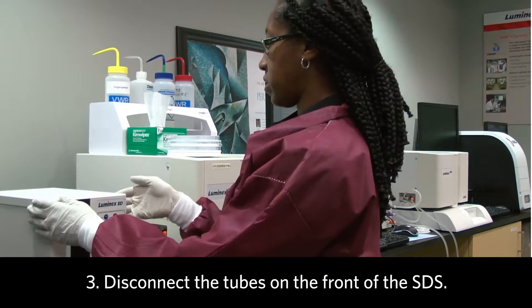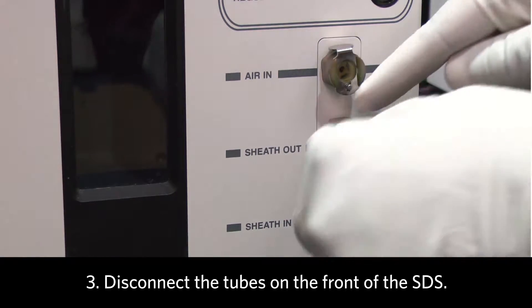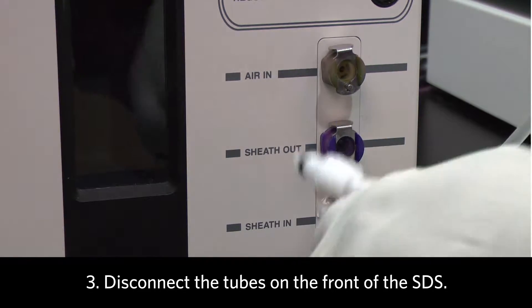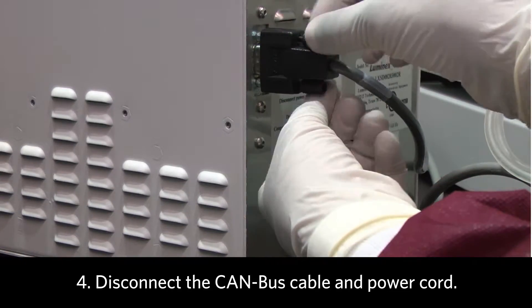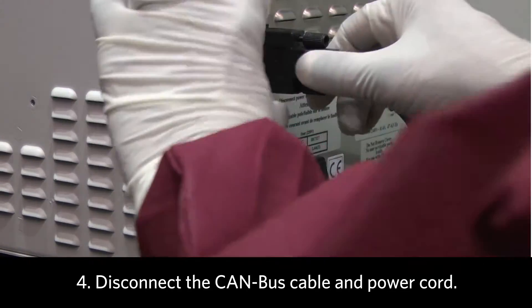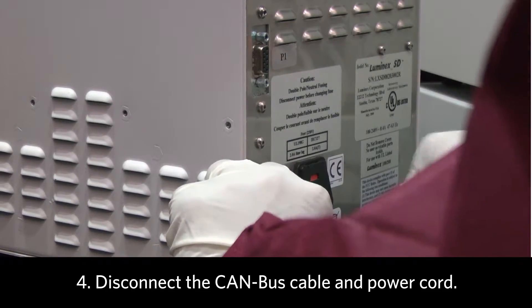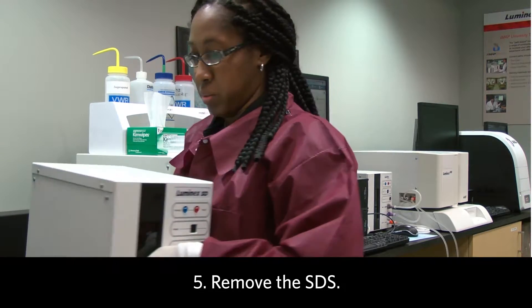Next, you want to disconnect the sheath tubing from the SDS. Also, disconnect the CAN bus cable from the SDS and the power cord. And then, move the SDS to a safe place.